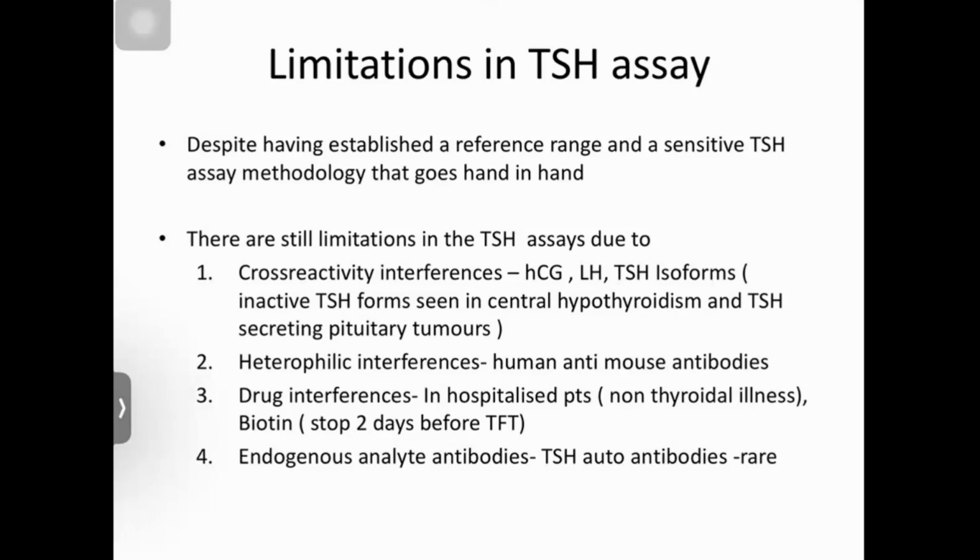So heterophilic interferences, like I said, anyone who has antibodies against immunoglobulins from the mouse, so human anti-mouse antibodies, that can also cause a falsely elevated TSH. And interferences from drugs, which I showed you in the earlier slide, can also have an impact on your TSH assay.